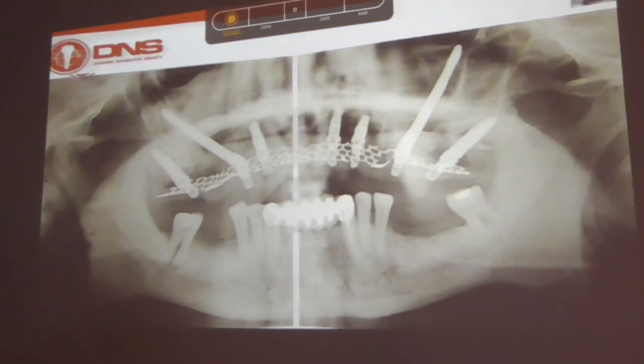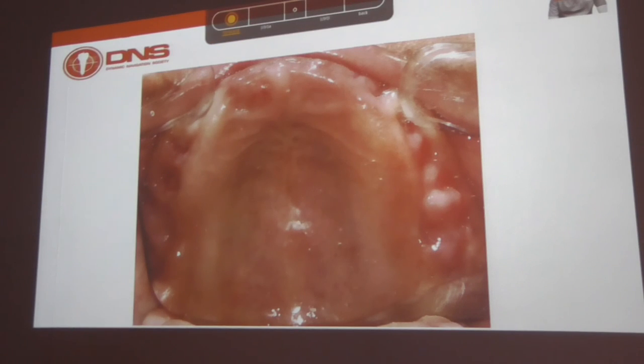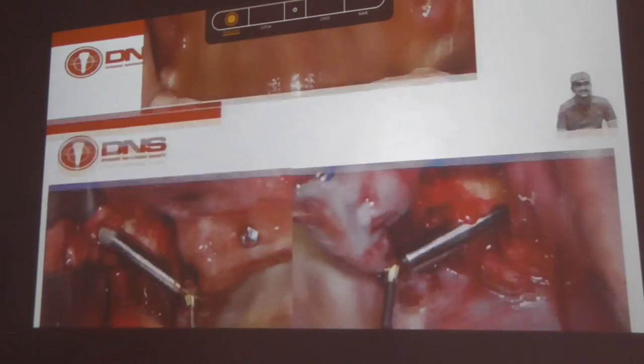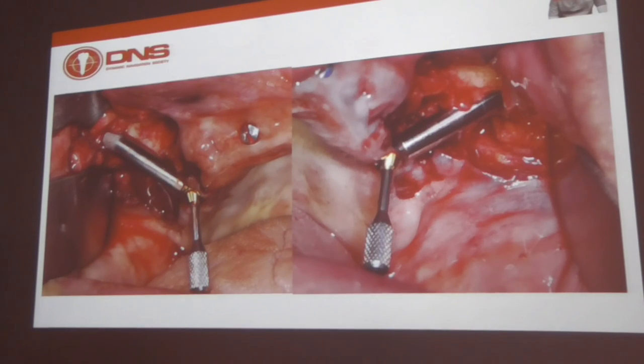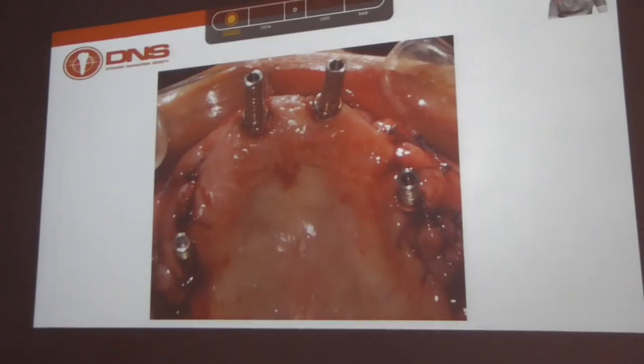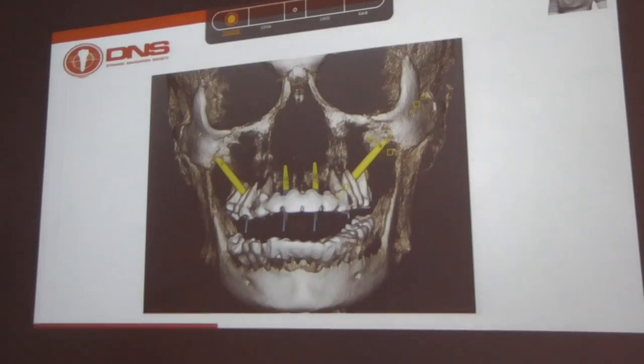And this is a case of just two zygomas and two regular implants. The protocol remains the same. I placed three screws only, though we decided five, because these two screws I always have to remove, so I don't place them anymore. Regular two anteriors, two zygomas, same steps.